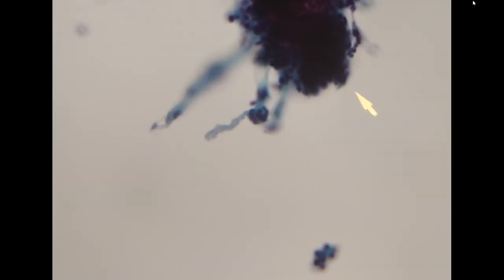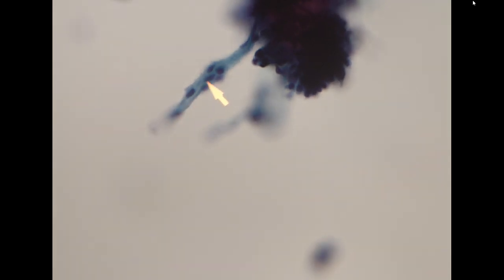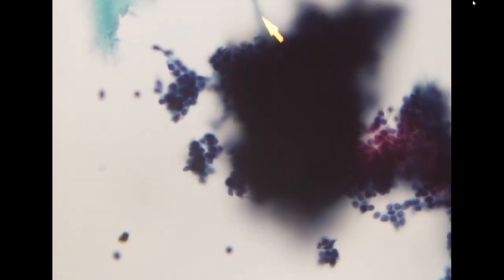The cells all look very uniform, but are arranged in very large sheets with a three-dimensional papillary feature. Additionally, this cluster has transgressing capillaries, so you can see the capillary goes through the cluster, right?